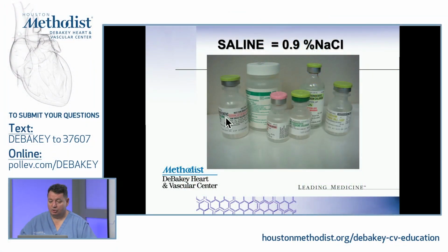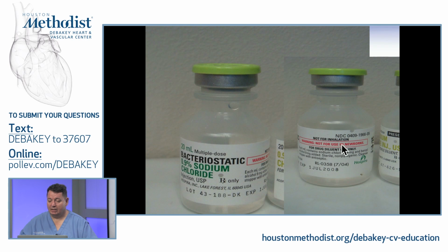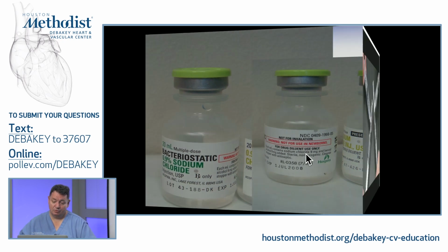I just want to show you there's a red label and a black label. Just remember that. So the red label, the warning not to use in newborn. Why? Because in the saline, they put a little bit of alcohol in it. You're not going to get drunk, but there is a tiny milligram of benzyl alcohol. And believe it or not, this is what is probably stabilizing my bubbles.